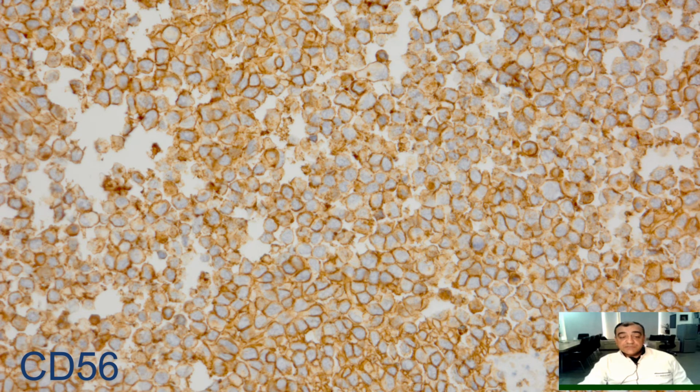Another marker which causes difficulties and can make things much more complicated is CD56, which is a very sensitive marker, not specific, for the cells of neuroblastic origin. After this, there are two pictures.